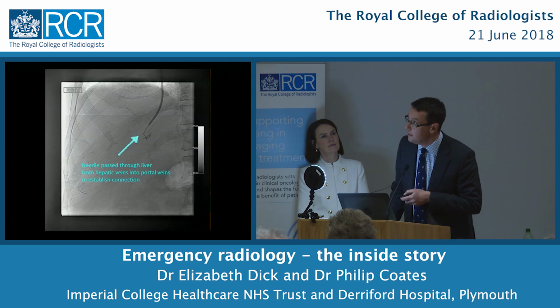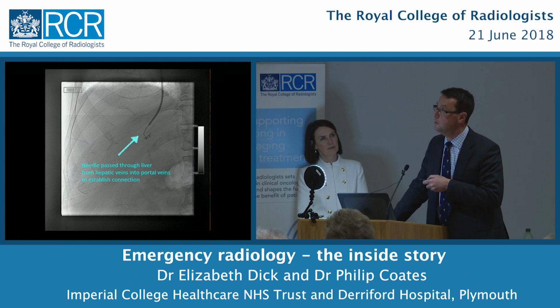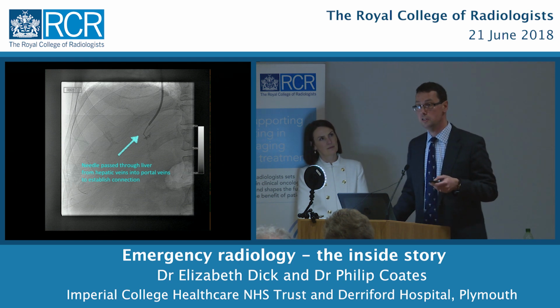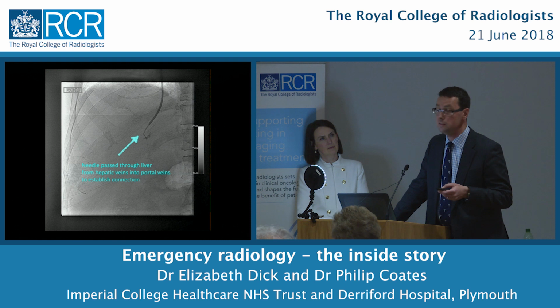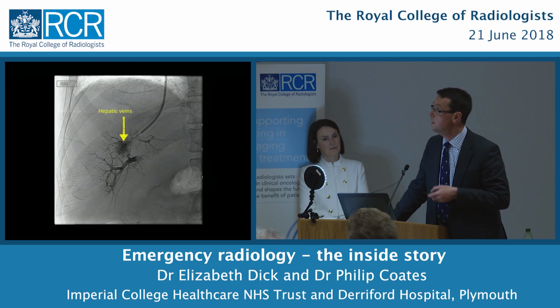She uses a needle which is about 1 metre long called a Colapinto needle and passes that through this catheter and effectively makes a hole through liver tissue until she accesses the portal vein. There's a good deal of trial and error involved in this. It's a difficult, long procedure. Sometimes you can hit it fairly swiftly, but it can take some hours to get through to that access. Now, Nila got through very swiftly in this case.